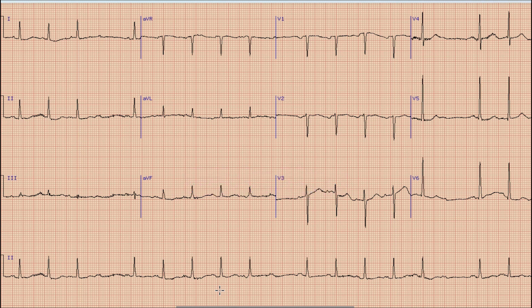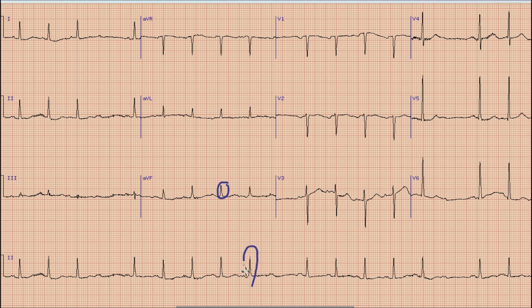Another important thing we can assess on the surface ECG is whether this block is present within the His bundle or below it. A pointer toward the block being within the His bundle is the presence of a narrow QRS complex. In cases where the block is below the His bundle (infra-Hisian), the QRS complex should be prolonged. Similarly, in infra-Hisian blocks the heart rate is usually low and we see bradycardia along with broad QRS complexes.